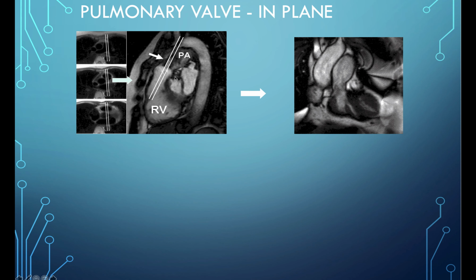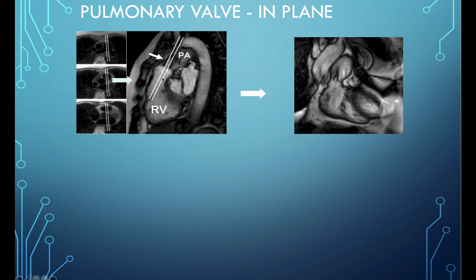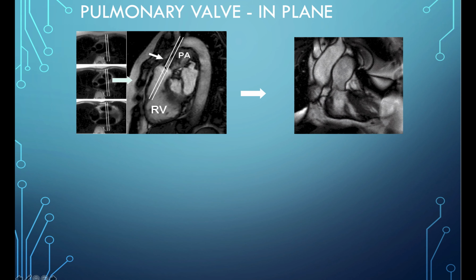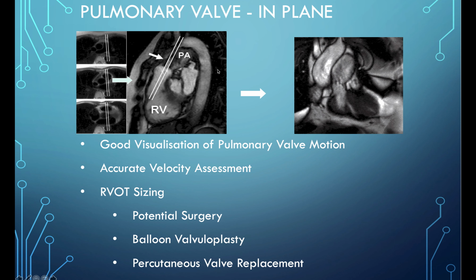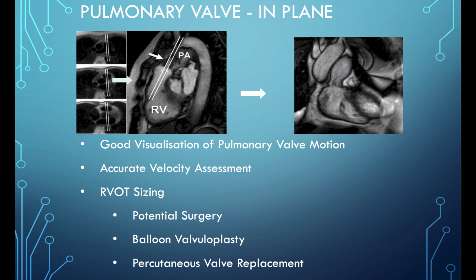And a line passing through the right ventricular outflow tract and pulmonary valve would provide you with another view, a coronal view for the pulmonary area. And again, similar to what we said about the left ventricular outflow tract, you could have an idea about the pulmonary valve, whether thickened or not, any kind of stenosis, and we have learned how to measure the Vmax.